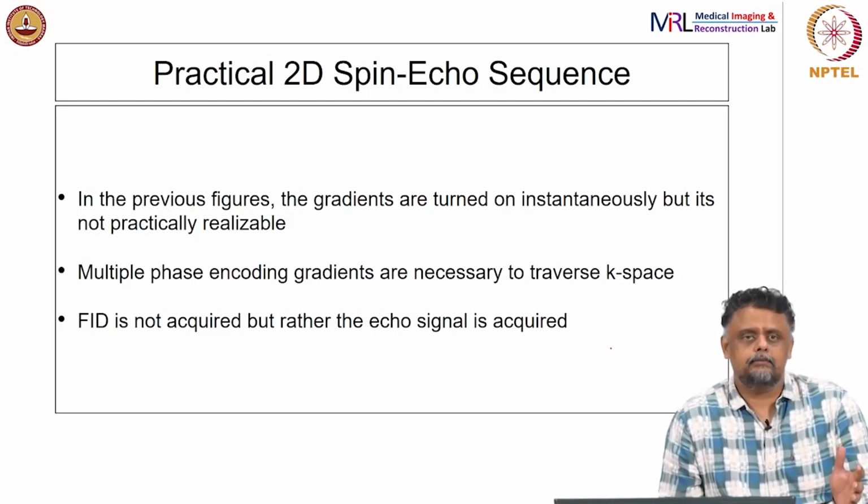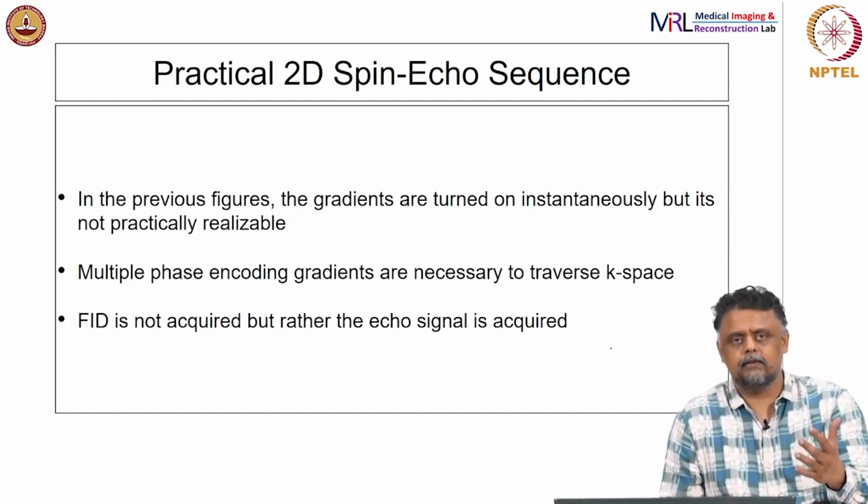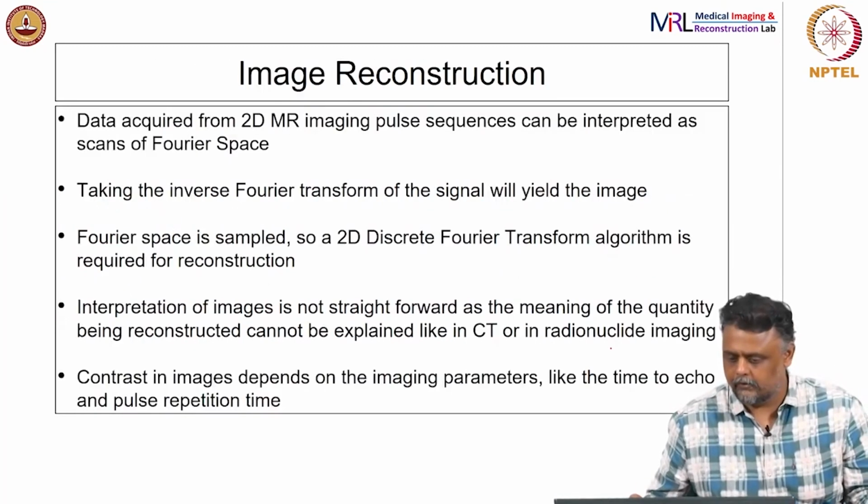FID is not acquired, right, only the echo signal is acquired, that is the only possible thing to acquire, at least that is the understanding. So, the echo signal is a better signal to acquire, not the FID, all right.